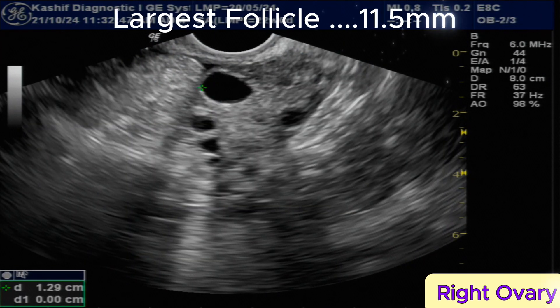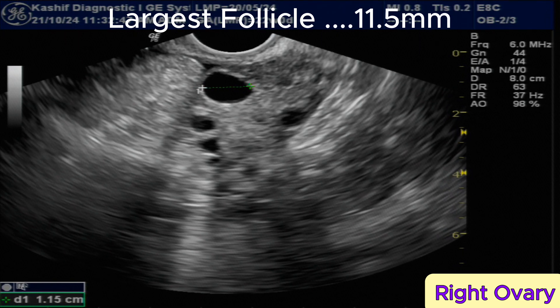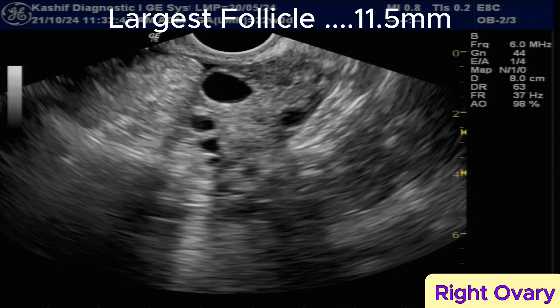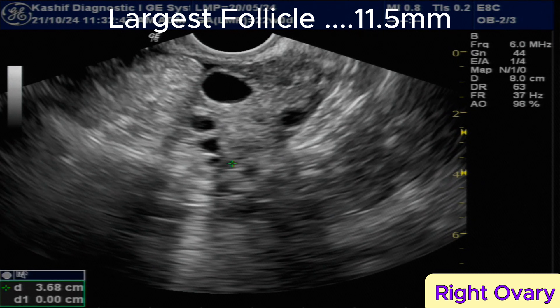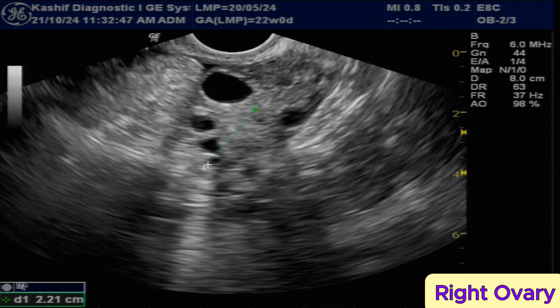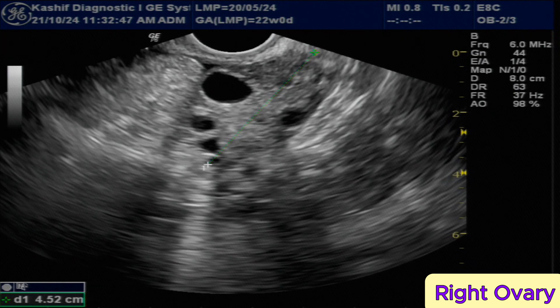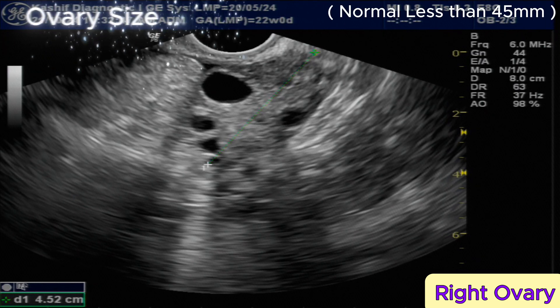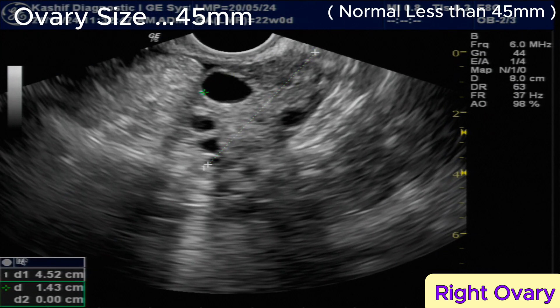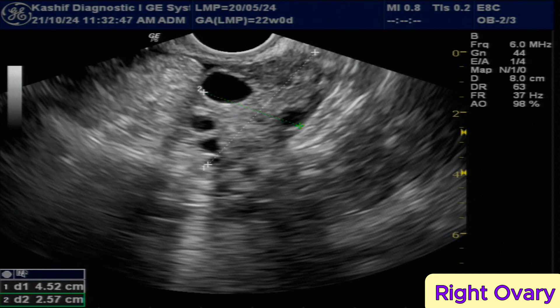This is the right ovary. The largest follicle in the right ovary is 11.5 mm, which is a small follicle for the 14th day of the cycle. The ovarian size is 45 mm and the volume is 22 cc.